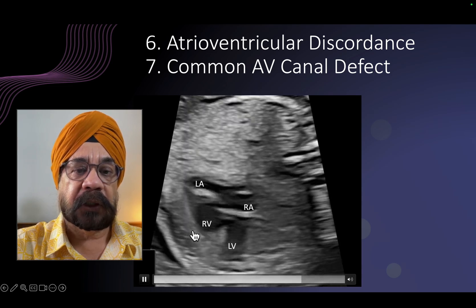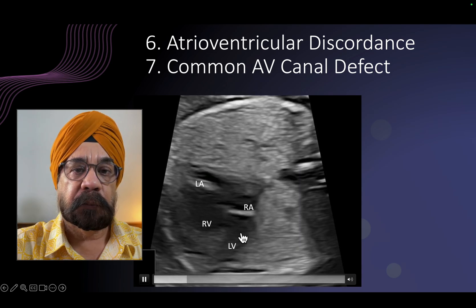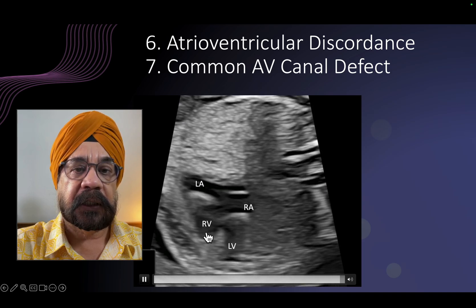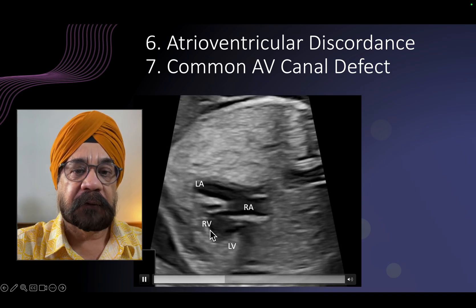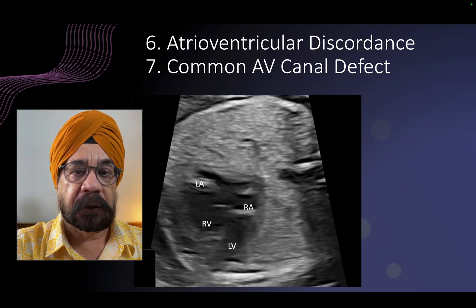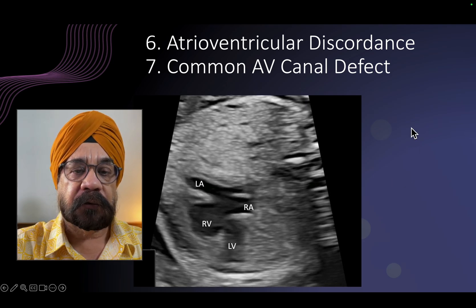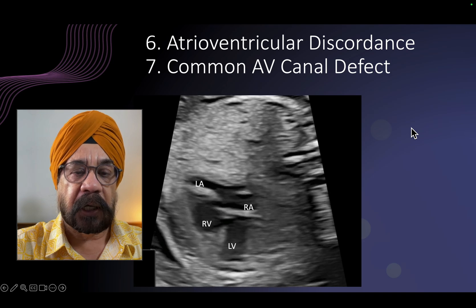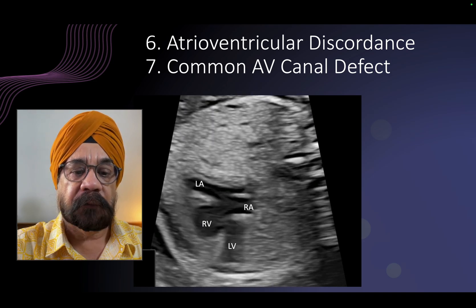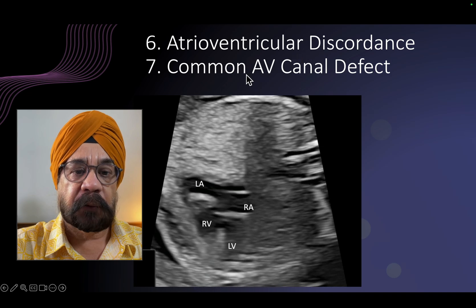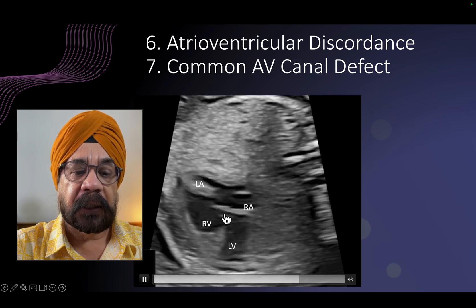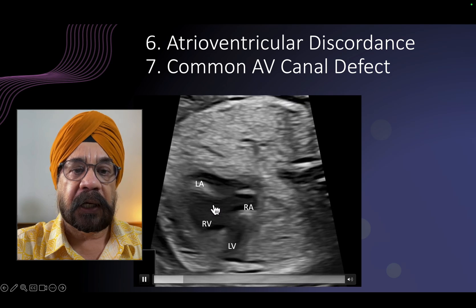The chamber the left atrium is connecting with is morphologically right ventricle. So this is the morphologically right ventricle, and this is the morphologically left ventricle. The left atrium is connected with the morphologically right ventricle, which is the hallmark of atrioventricular discordance — and this kind of arrangement happens in congenitally corrected transposition of the great arteries.